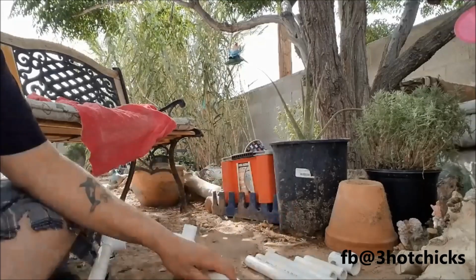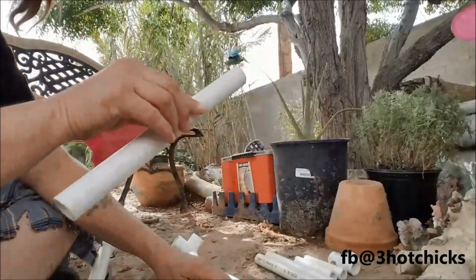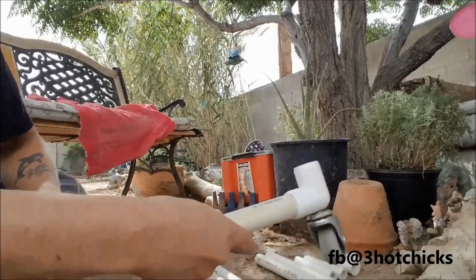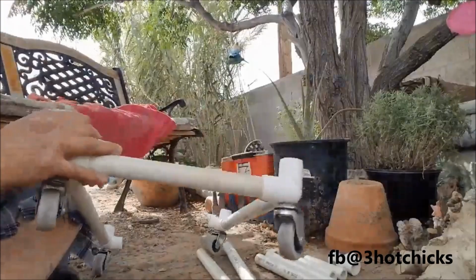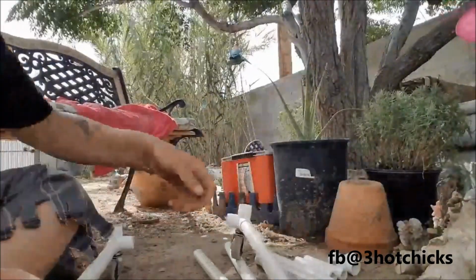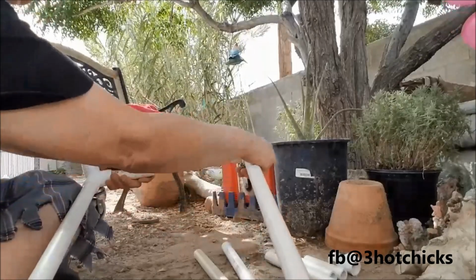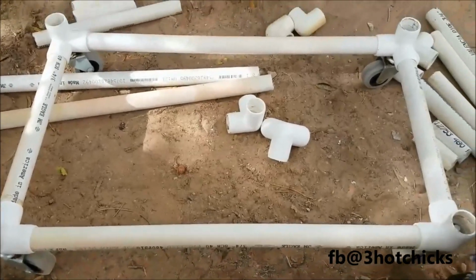I've got 4 pieces for the sides. So we got 2 on the bottom, and then 2 are going to go on the top. So then we just screw them together here. So it's like that. And then we're going to take the other piece here and screw it together. So now the bottom of the wheelchair looks like that.